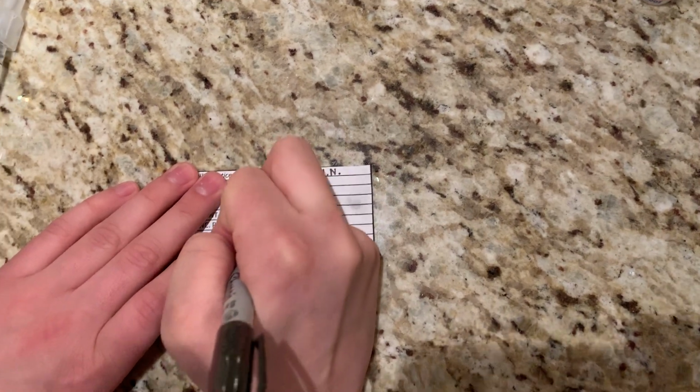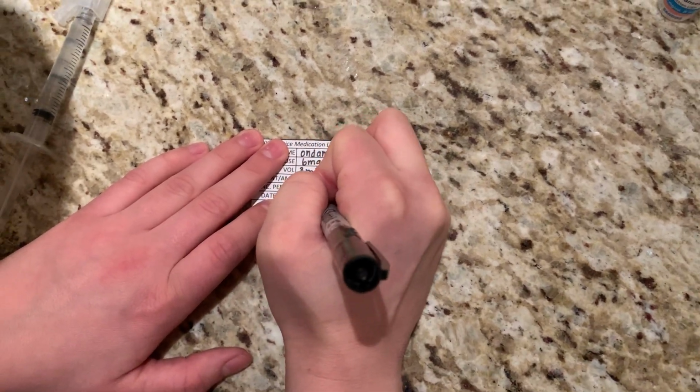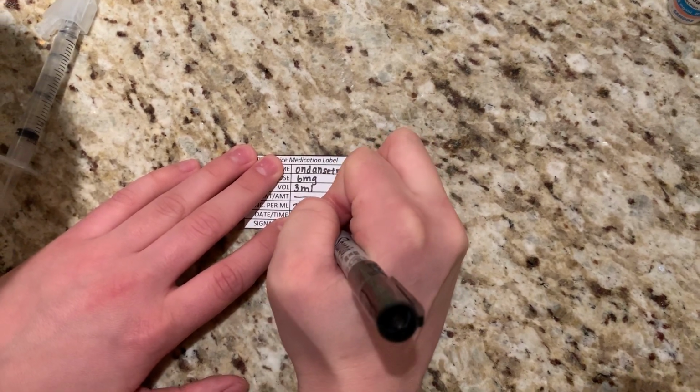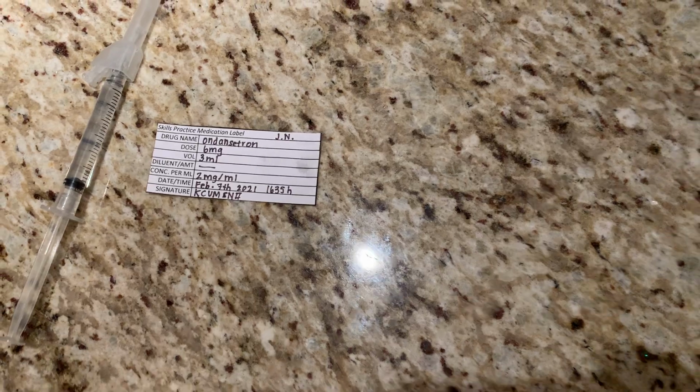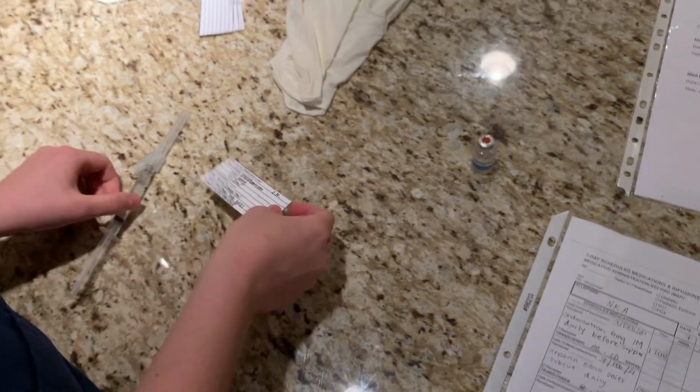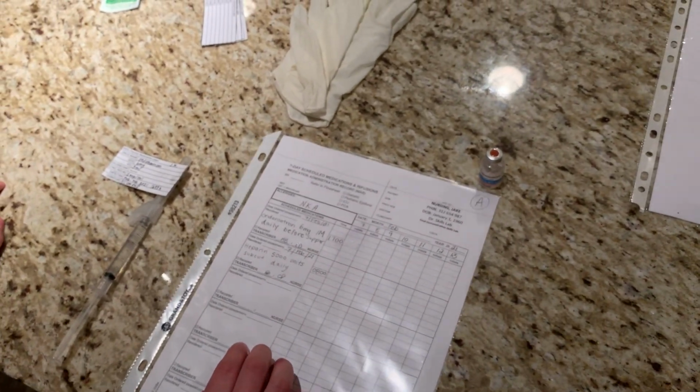And I'll put my signature, KCUMSN2. And then I would attach that onto the cap. Once I'm done that, I can do my second check of my medications.